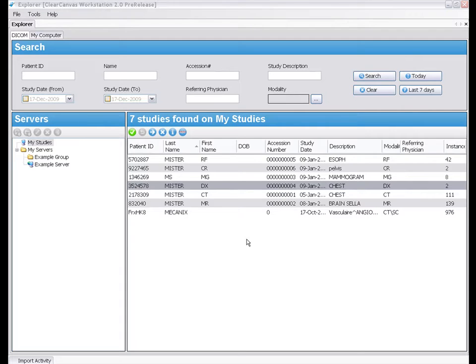The External Applications feature allows you to easily launch command line executables from within ClearCanvas Workstation.